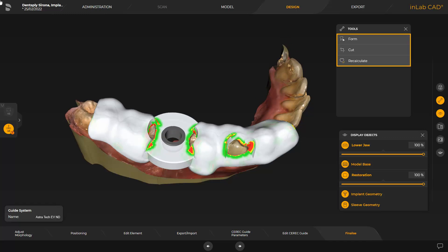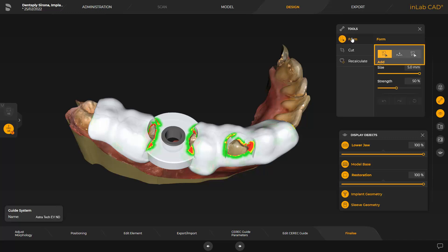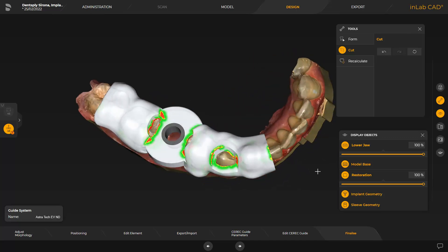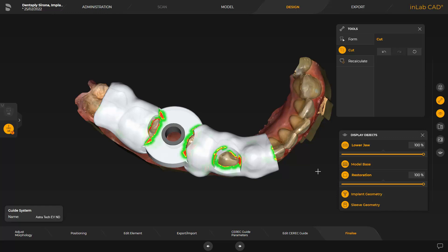Again, there are three tools available here. With the Form tool, you have the option of adding, smoothing, or removing material in certain areas of the surgical guide. The size and strength of the tool can be adjusted using the sliders. We move on with the next option, Cut. This tool allows for final shortening of the surgical guide. For demonstration purposes, we place a centered cutting edge on one of the front teeth. We start with a double click and place the cutting edge with an additional double click. This cutting edge provides another opportunity to review the final position of the surgical guide inside the patient's mouth. When enabling the third tool, it is possible to have the guide recalculated if necessary.